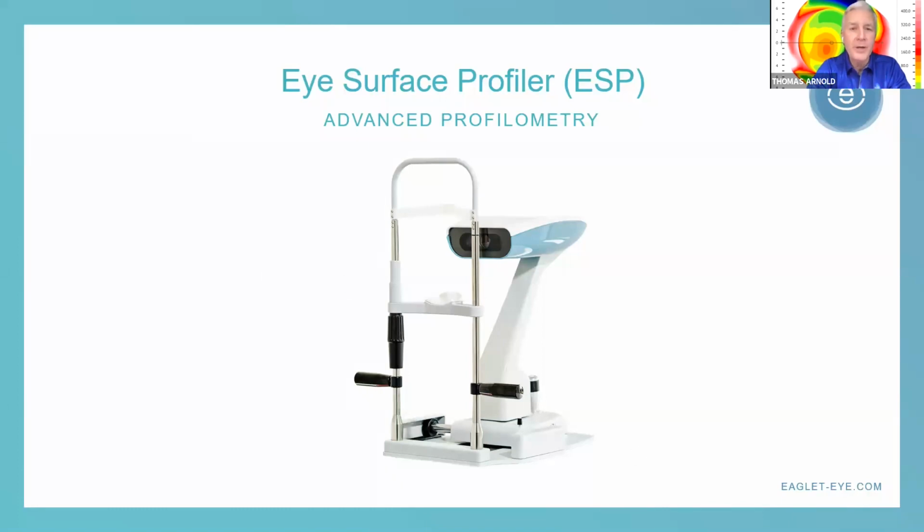It can fit about anywhere. Worked with a number of different computer options. So very, very small, very compact, very easy to use. And we'll demonstrate that as we go forward.